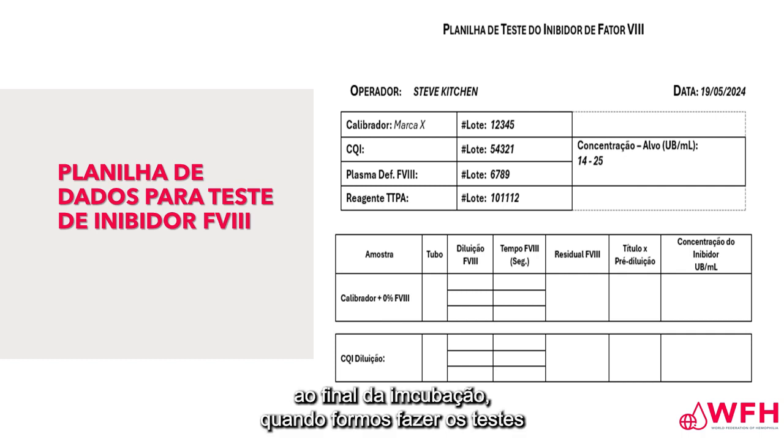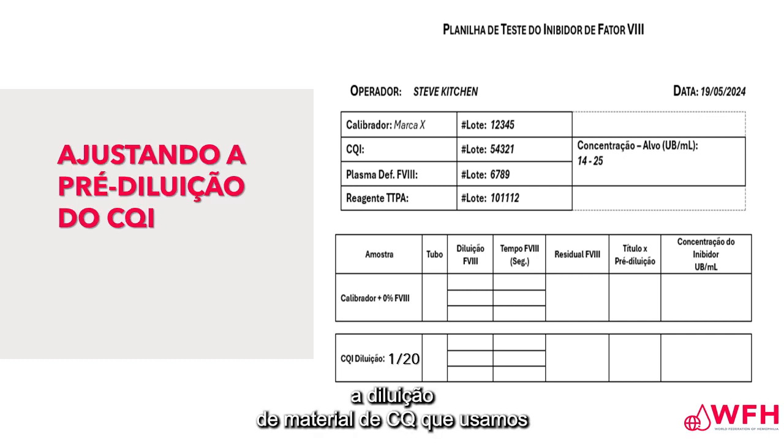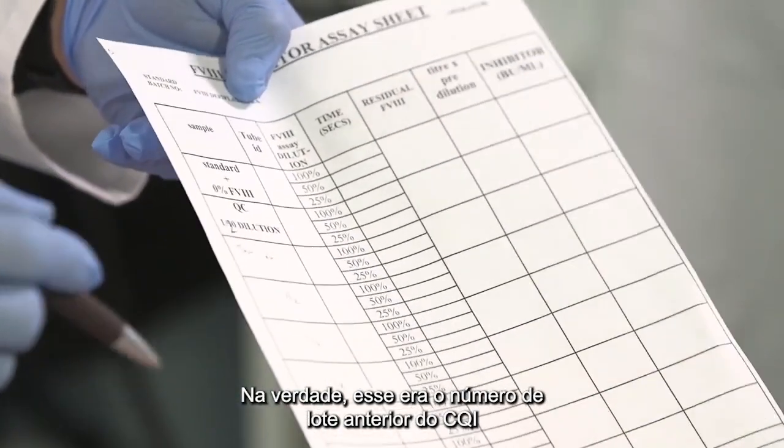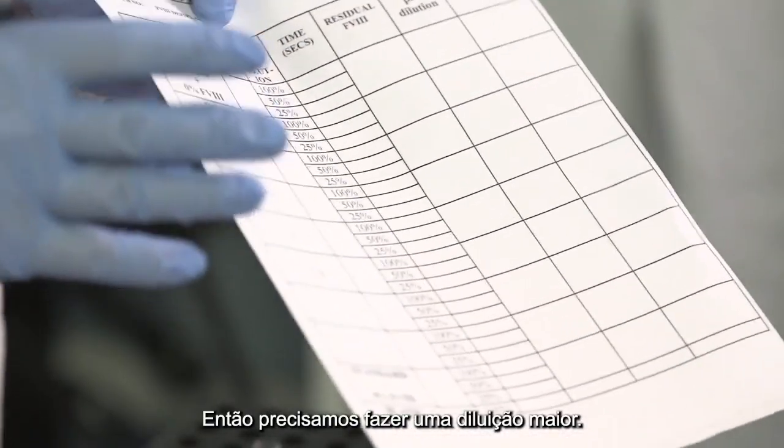When we come to make the factor VIII assay at the end of this incubation, you'll see that we will use multiple dilutions, so we have the opportunity to store that information. For now, we should record the dilution of QC material that we've used, the lot number of QC. So this is recorded on this sheet, so we know which dilution we used. The printed form said 1 in 10. Actually, that was the previous lot number of IQC. The current lot number has a little higher antibody concentration, so we need to make a higher dilution.